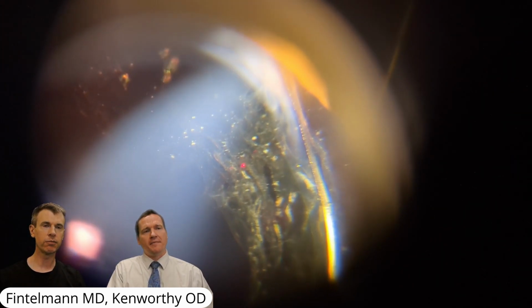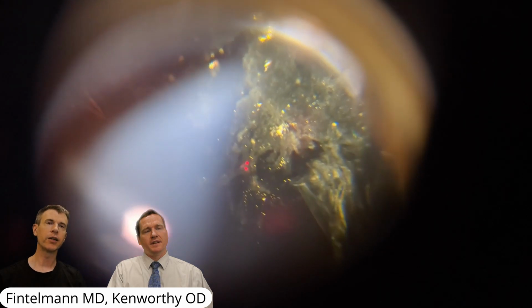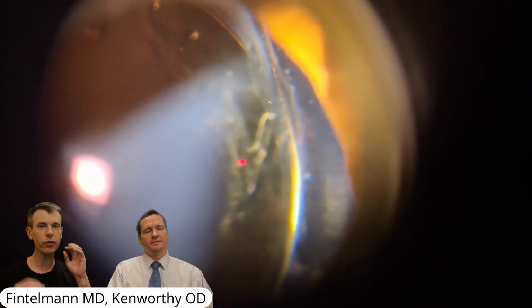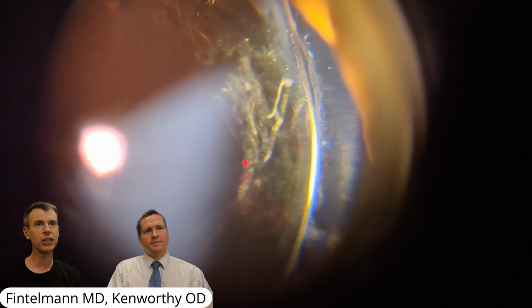So one patient, it recurred after years. Another patient recurred within a few months. And this patient had had a cataract surgery over 10 years ago, and then had a YAG capsulotomy shortly after. And she noticed still over the last few years, the vision had decreased again.